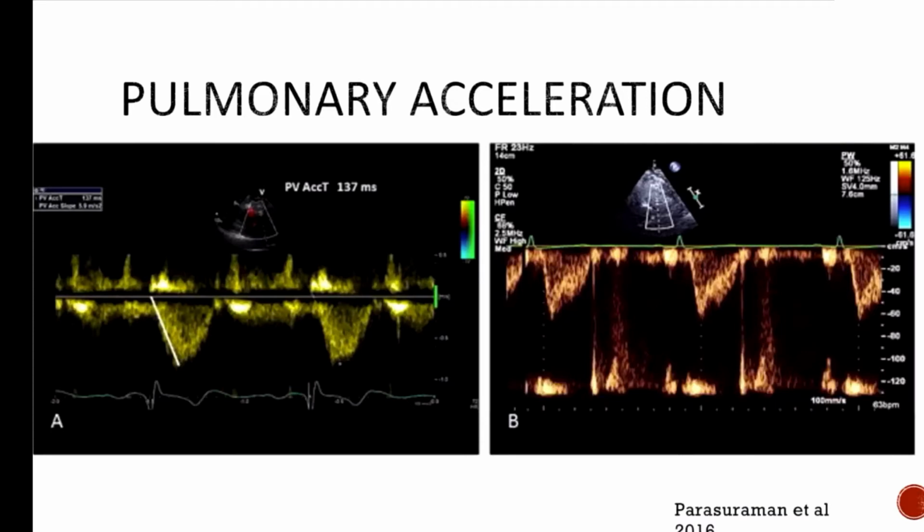So pulmonary acceleration time. Basically what we're looking at here is our pulmonic valve outflow tract. When we do our parasternal short axis view and we tilt upwards, well, that's a very atypical aortic valve, so don't pay attention to that. We fan upwards and we start to see our RV inflow-outflow view, right? As we fan upwards, look more anteriorly, and drop the tail of our probe down towards the body, we start to see our mitral valve, right? If we fan further up, we start to see our Mercedes-Benz sign, which this doesn't look like.